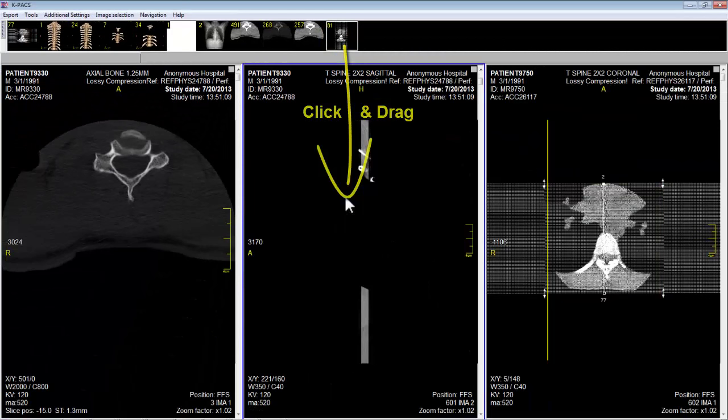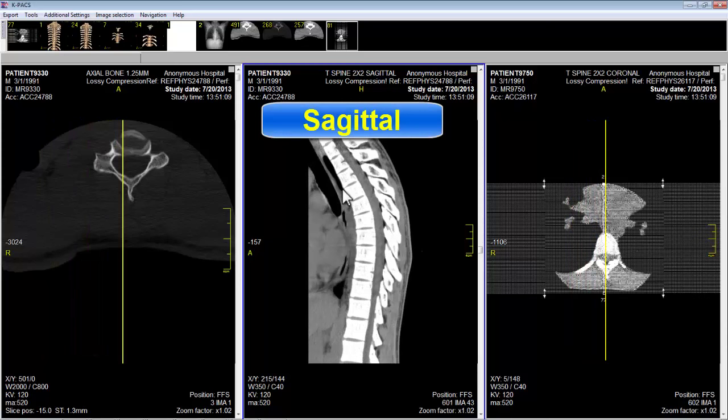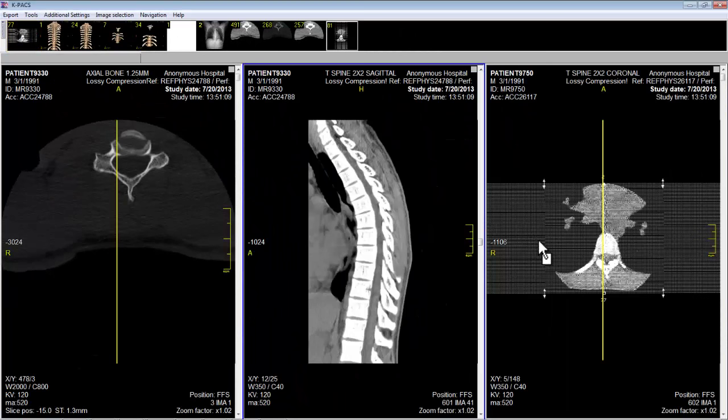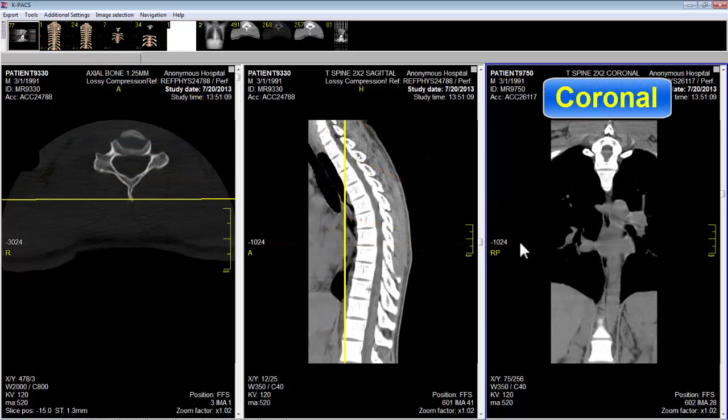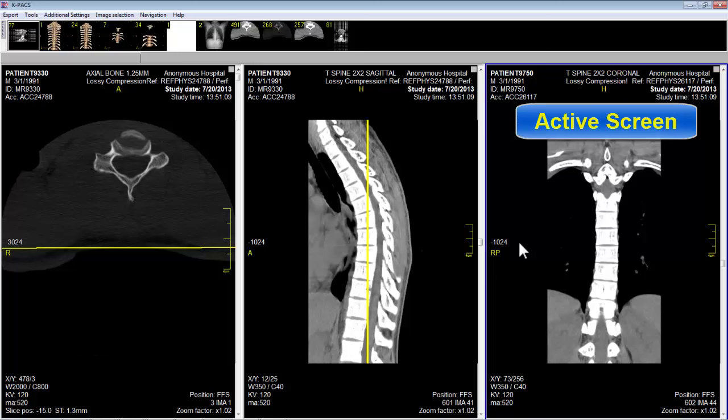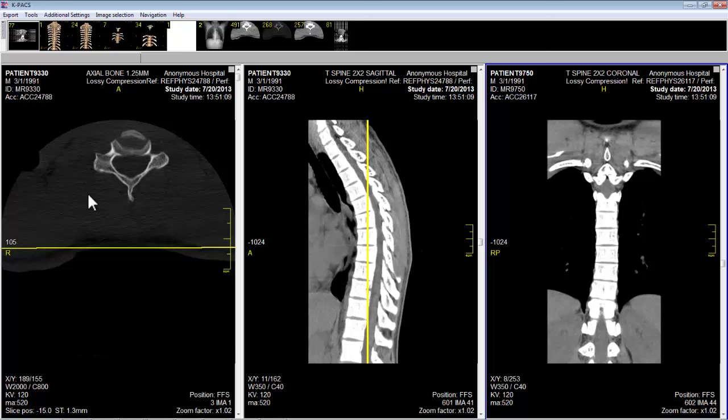I'll scroll through it using the scroll wheel on my mouse until I'm in the middle of the sagittal section. Then I will go to the very first left-hand image stack, click on it, and pull it all the way to my right tile screen. I'll use the scroll wheel on my mouse to get to the middle of the coronal section. Now notice that I can only have one active tile screen at a time — right now it's the coronal section. Let's move over to the left, to the first tile screen, and click on it.